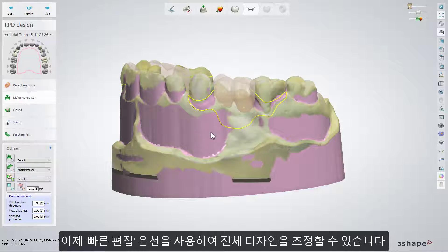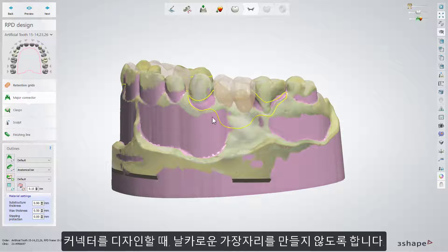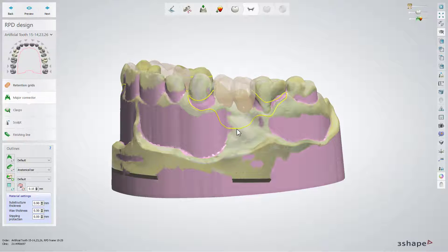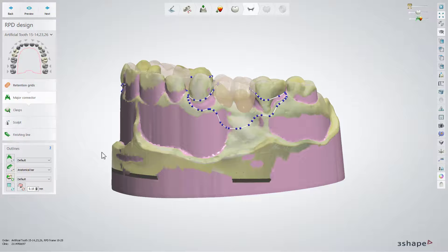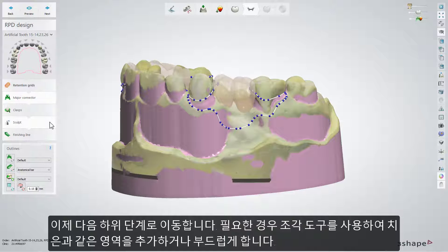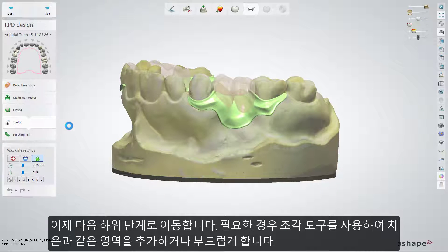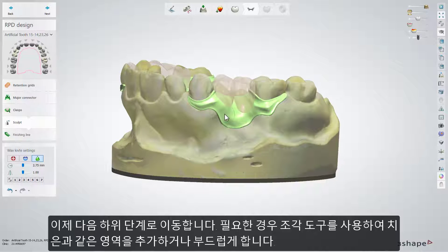Now you can use the fast edit option to adjust the whole design. Try to avoid making sharp edges while designing the connector. Now you can go to the further sub-step and use the sculpt toolkit to add or smooth the area if needed, for example the gingiva area.